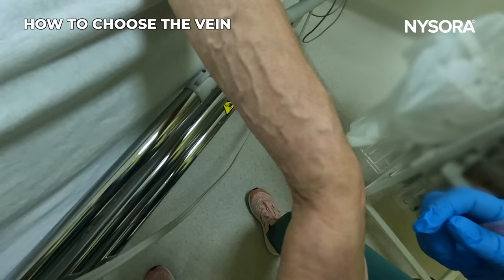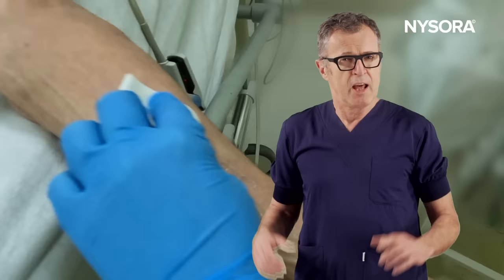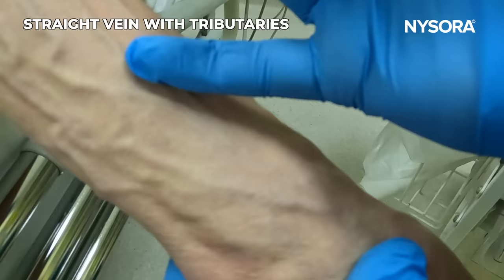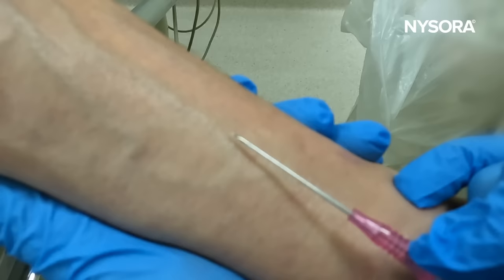My personal preference here would be to turn the handle around and take this vein right there, because it's fixed there. Here we chose the straightest vein and the one that also has tributaries for better stabilization. The practitioners here stabilize the skin nicely. However, the stabilization method used partially emptied the vein, as the tension on the skin was across the area side by side, instead of pulling the skin more distally, which is usually preferred as it does not empty the veins as much.